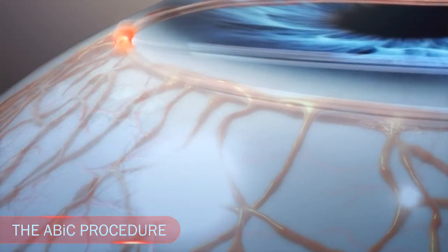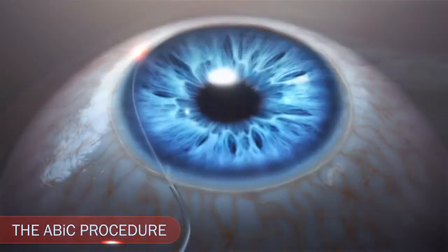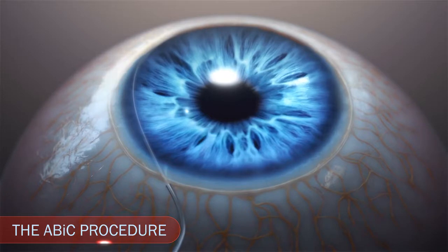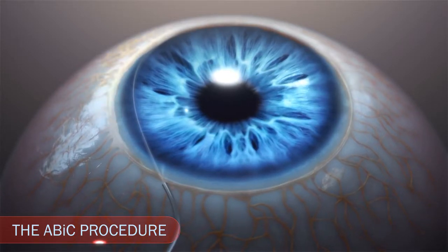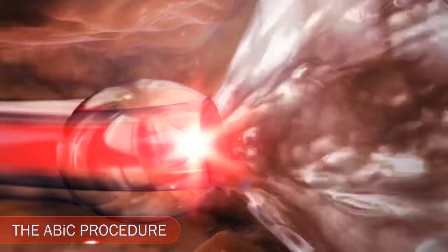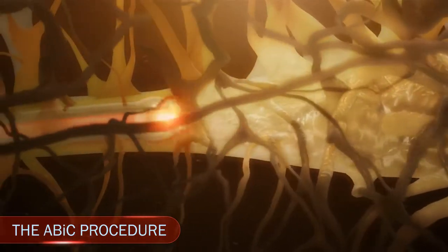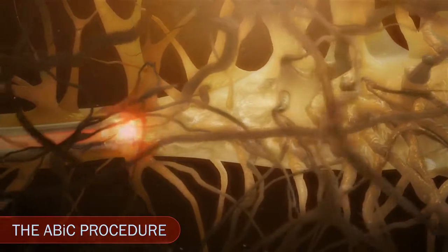Slowly, your surgeon will withdraw the iTrack microcatheter, while sterile viscoelastic gel is injected into the canal to dilate it to two to three times its normal size. Enlarging and flushing through the drainage canal and adjacent outflow channels helps the aqueous fluid to drain properly. The iTrack microcatheter is then withdrawn from the eye.